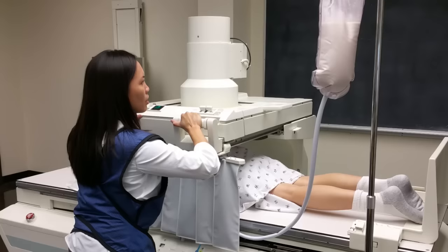A post-evacuation x-ray may be obtained to demonstrate delayed barium filling of tracts in patients suspected of having diverticulitis or fistula, or sometimes in patients whose appendix or terminal ileum did not fill with barium. The patient should be instructed to drink large amounts of fluid after the examination, and they are able to resume their normal diet. I also tell patients that it is normal to see white or gray in their stool. After reviewing the exam and images with a radiologist, dictate the report of the examination and findings. If there are critical or unexpected findings that need immediate attention, the referring physician should be contacted and that communication noted in the report.